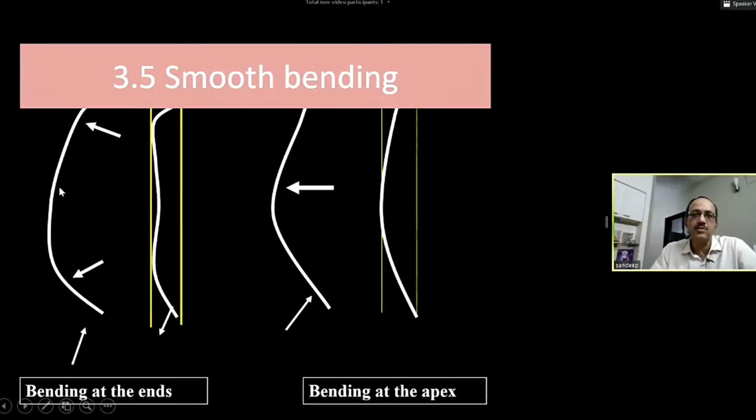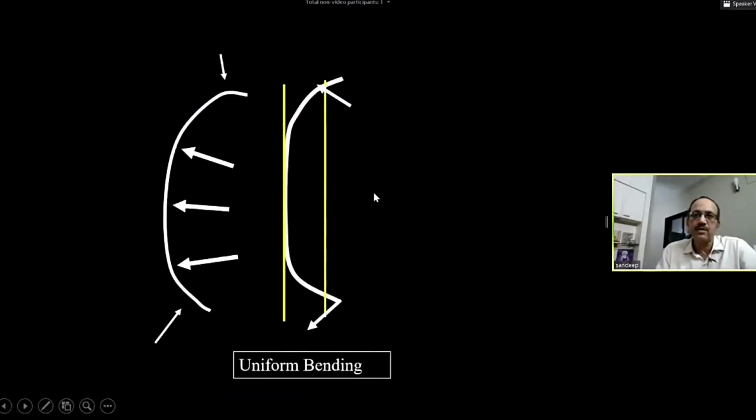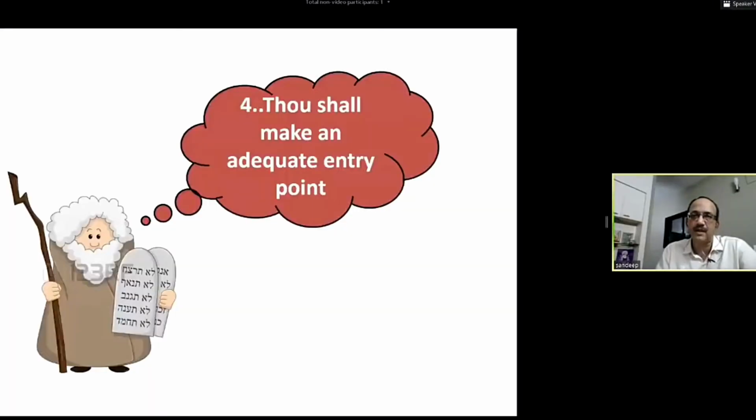Don't bend at the ends too much and very little in the middle, right? So bend at the apex first and then smooth curves on either side so that it forms a uniform arc, right? Uniform bending will give you excellent recoil.